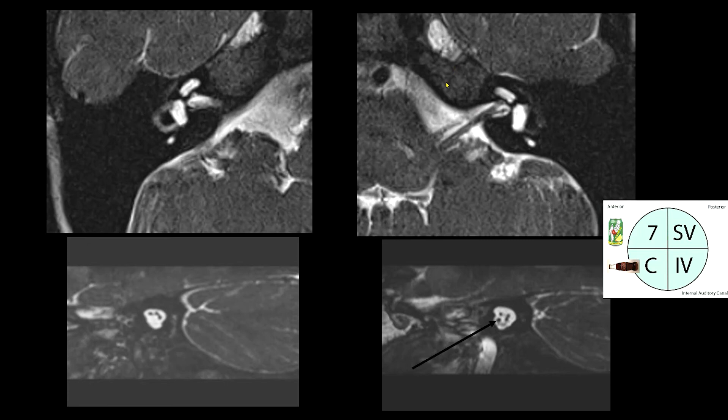In this example, we can see that anteriorly is the front of the face, and posteriorly is the cerebellum. We can see anterior and superior — the seventh cranial nerve; anterior and inferior — the cochlear nerve; and more posteriorly within the internal auditory canal are the superior and inferior vestibular nerves.